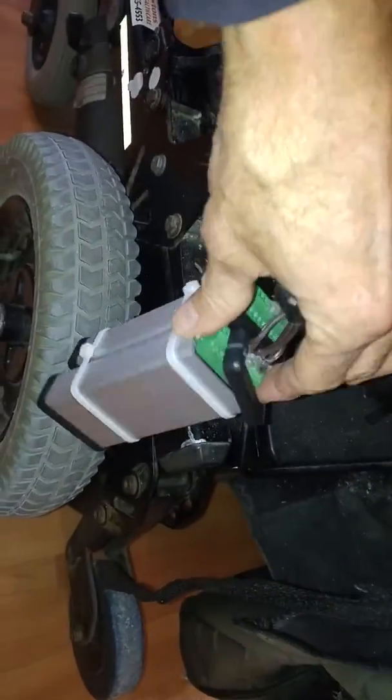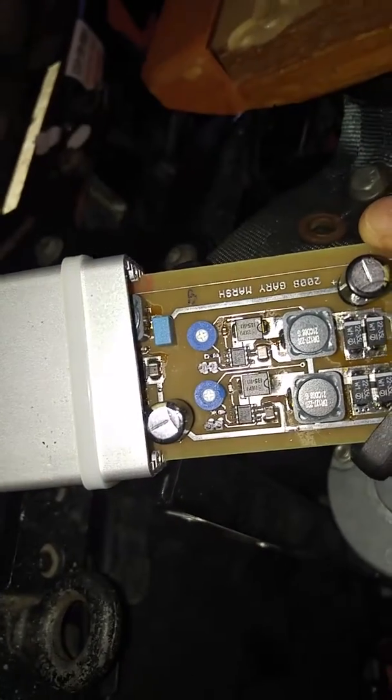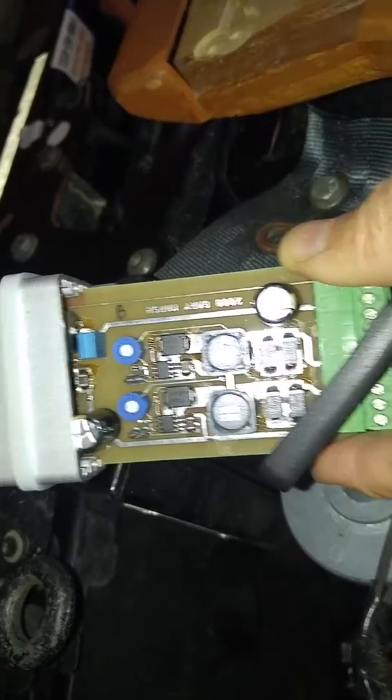Make sure the power is off before you pull anything out. On the power supply are two potentiometers — little Phillips heads on the little round blue things there — and you just adjust those. Rotate them clockwise for more voltage or counterclockwise for less voltage.